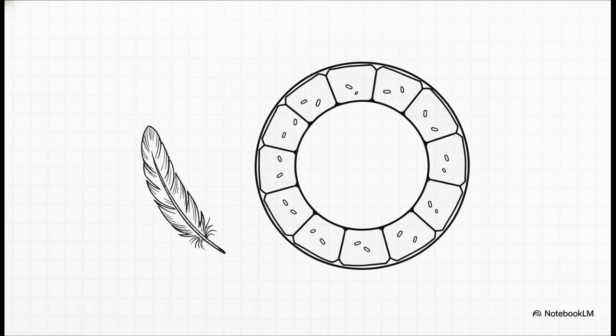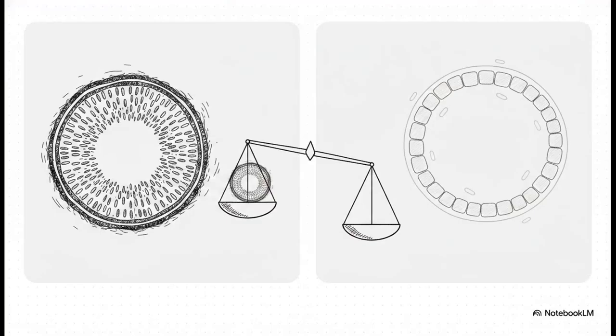Plus, since it's doing way less active transport, it has fewer mitochondria, which means its cytoplasm is noticeably lighter and far less acidophilic. Let's put these two side by side to really cement this concept, because it all boils down to the fact that form follows function.